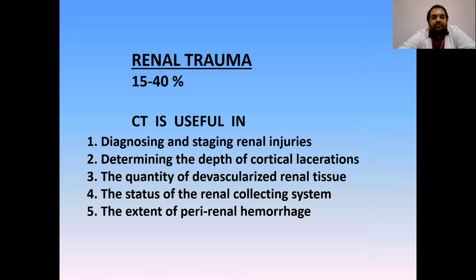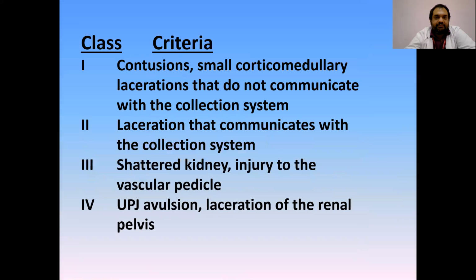Renal trauma, seen in 15 to 40% of the cases. The CT is useful in diagnosing and staging renal injuries, determining the depth of cortical lacerations, the quantity of devascularized renal tissue, the status of renal collecting system, the extent of perirenal hemorrhage.